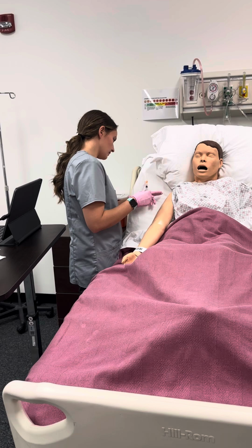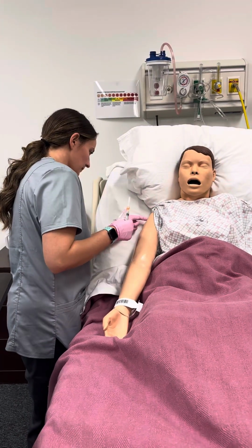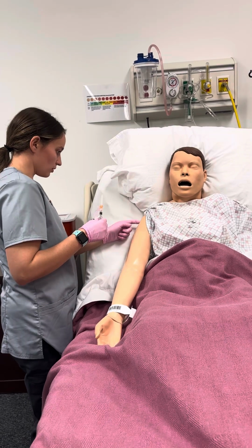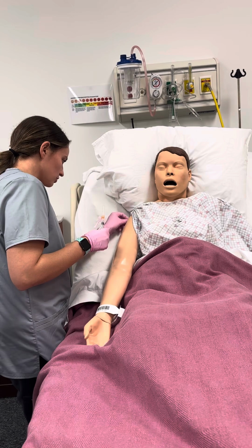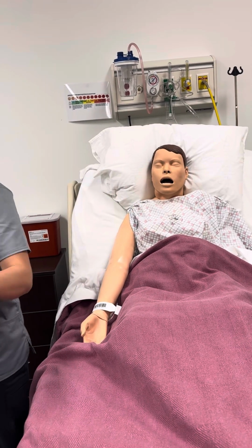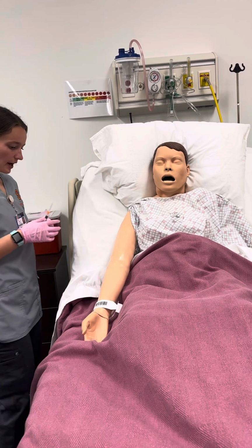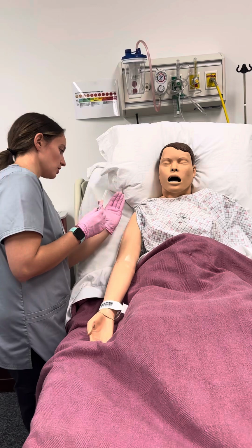So first of all, I'm gonna put 2 fingers right here, right on the bone, right below, and I'm gonna make sure I know where I'm going to insert this medication. And then I'm going to just go in a circular motion with this alcohol wipe. Okay, I'm gonna let that dry. And after I let it dry, I'm gonna do the Z-Track.